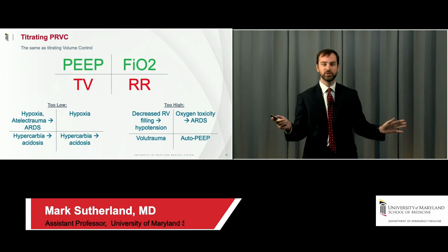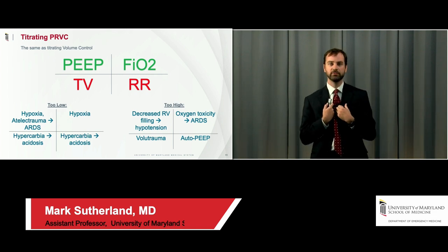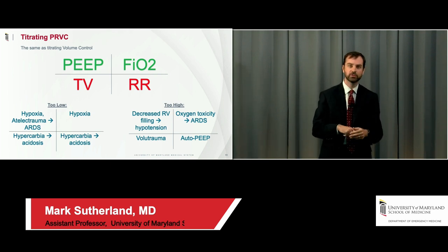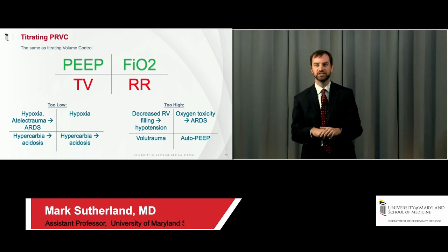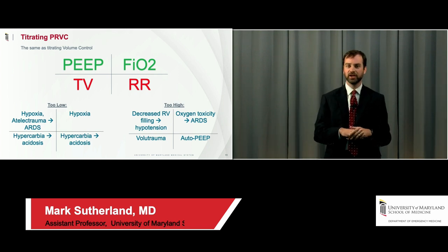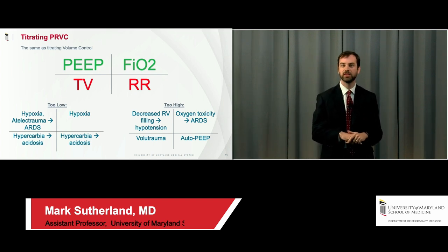So the good news for PRVC is titrating PRVC is identical to titrating volume control. There's no difference at all. From our perspective, again, PRVC is volume control. And I know Dr. Allison walked through in great detail how to set vent settings on standard modes like volume control, so I'm not going to review this in detail. If we have any med students or interns watching who haven't done MICU yet, you may want to take a screenshot of this slide. This is, at least for me, the way my brain works and the way I think about basic vent settings in a mode like VC.